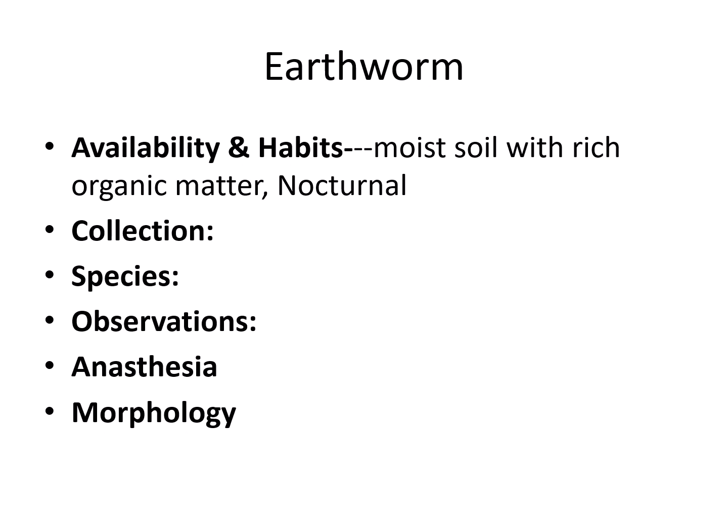We have to put chloroform on cotton wool and place it near the earthworm in a closed container, and then their body could be washed with water and they could be dissected. So chloroform and 10% ethanol can serve as anesthesia for earthworms.